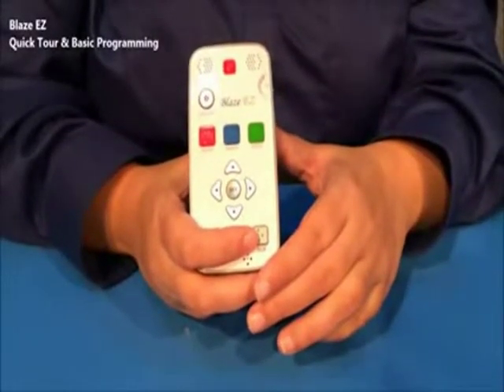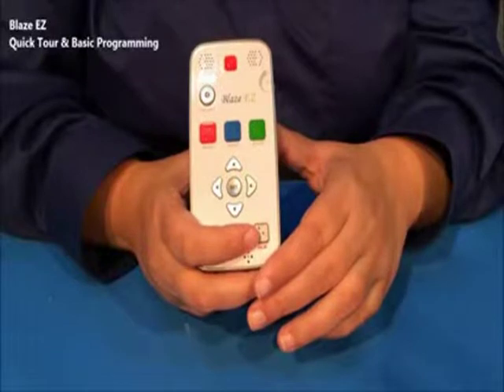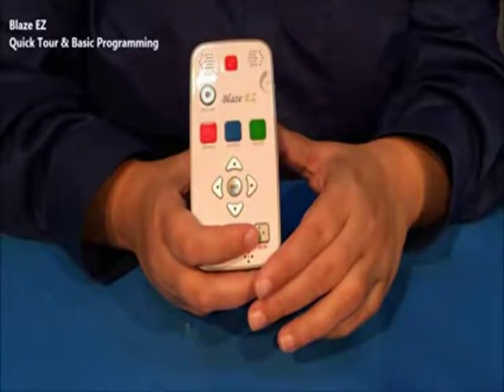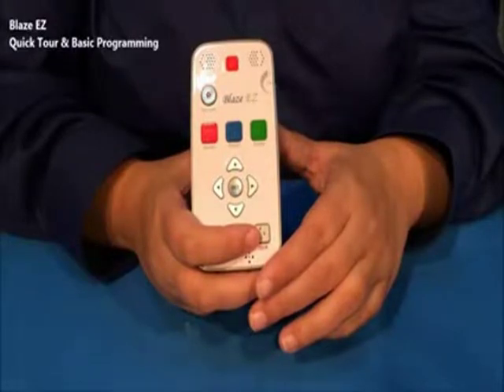The book reader will actually play both documents and DAISY books. So you can play text files and Word files in the book reader as well as DAISY content.